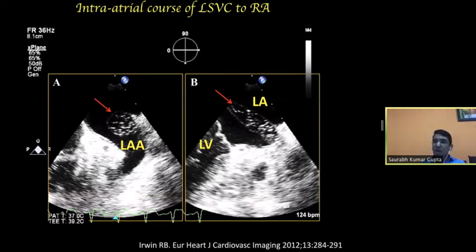Now, some important reports from the literature. Now, in this case, just by doing saline contrast echocardiography, the authors of this article, which was published in 2012, could confirm the physiological and anatomic basis of a mass lesion, which was seen in relation to left atrial appendage, and they almost made up their mind that this patient is actually having a left atrial mass.